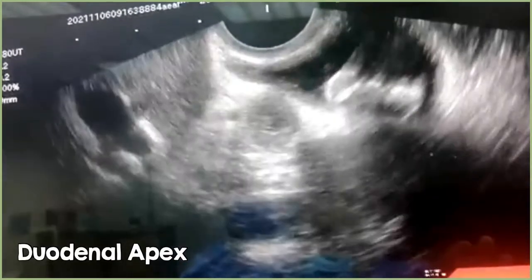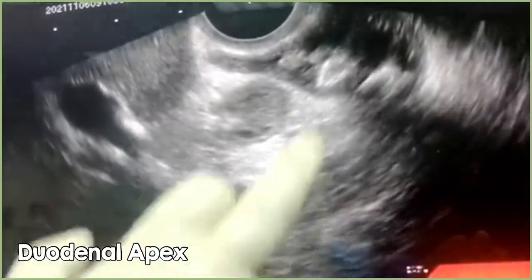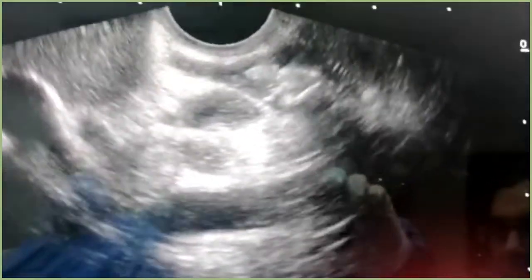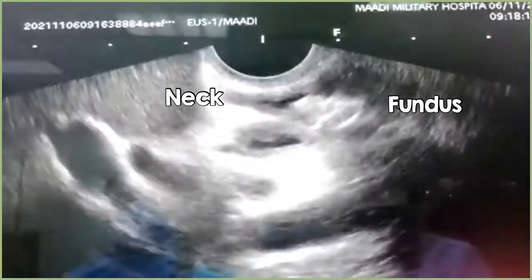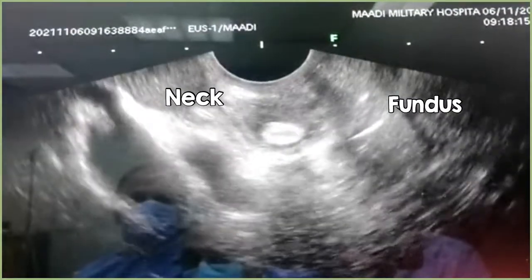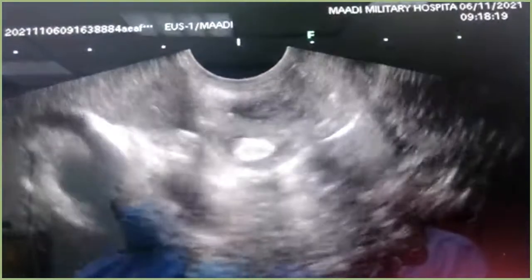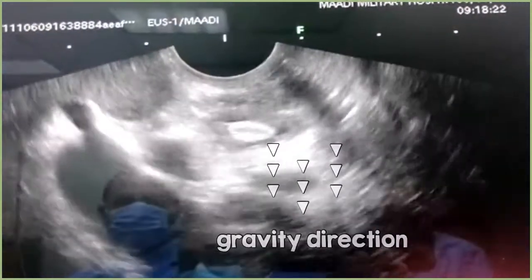This is a gallbladder with multiple stones inside, and this is the cystic duct. This is the gallbladder communicating with the cystic duct, and there is a stone here in the cystic duct.